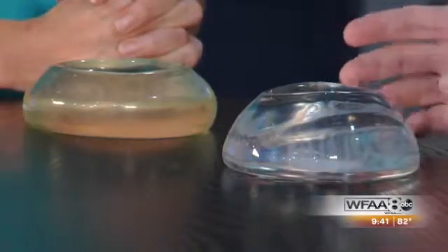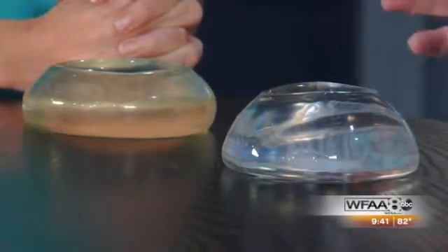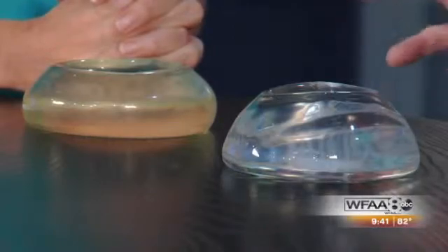Let's talk a little bit about the concern. What were those concerns about the silicone implant? The old silicone gel implants had a jelly-like substance inside of the implants, and this jelly-like substance could ooze out of the implants. We call that a bleed, and that oozing of the silicone would cause a reaction. Reaction of the tissue would cause scarring. That scarring would result in a hard capsular contraction. And so a lot of people say, well, my breasts are real hard after I did those implants, and that's because of the capsular contraction, that hard scarring that occurred.